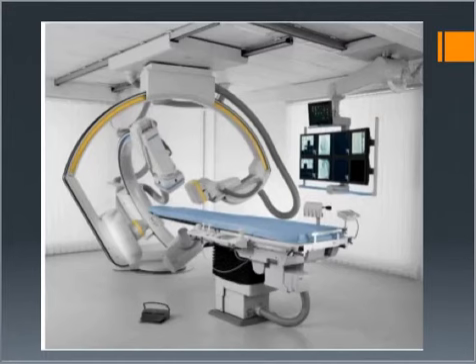This is another one. It's very similar, just a different view. This one has the two machines together. So you've got two different views. And what's nice about this is this one can do the CT slices because you've got two different views, so you don't have to move the machine as much. And again, you've got your monitors over here where you can see everything.